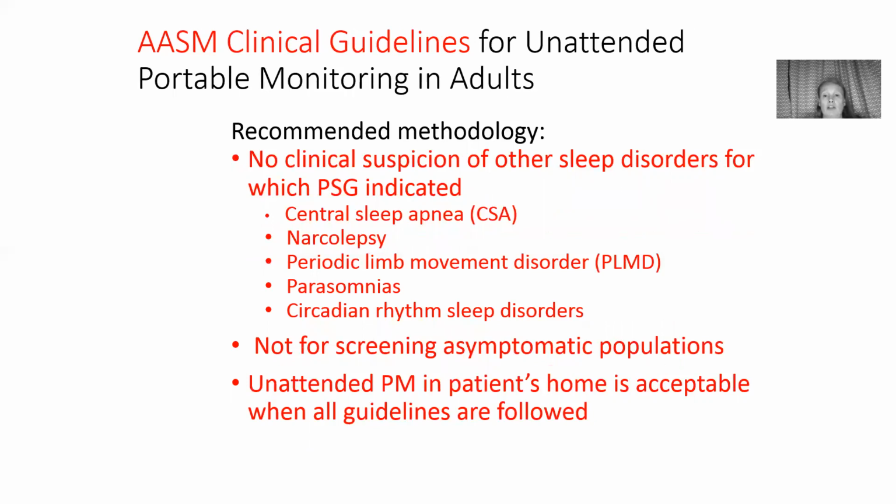No clinical suspicion of other sleep disorders for which an in-lab sleep study would be indicated. So if you have any suspicions of central sleep apnea or narcolepsy, periodic limb movement disorder, parasomnias, or circadian rhythm disorders, any clues of that would rule out the indication for doing a portable monitoring. You shouldn't use it as a screening tool for patients who don't have any symptoms, and then unattended portable monitoring in a patient's home is acceptable when all guidelines are followed.